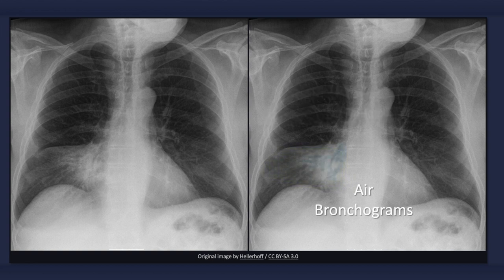Another finding that is a little more difficult to appreciate is the presence of air bronchograms. Air-filled bronchi that are surrounded by alveolar infiltrates can appear as dark, radiolucent branching columns within the area of opacification.